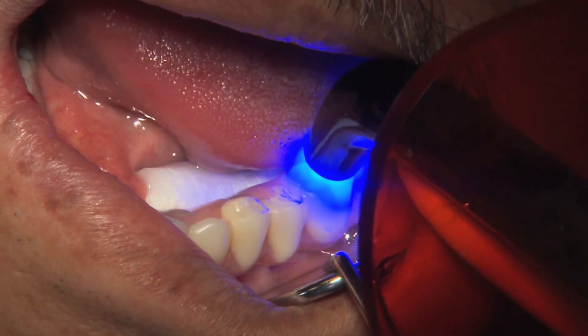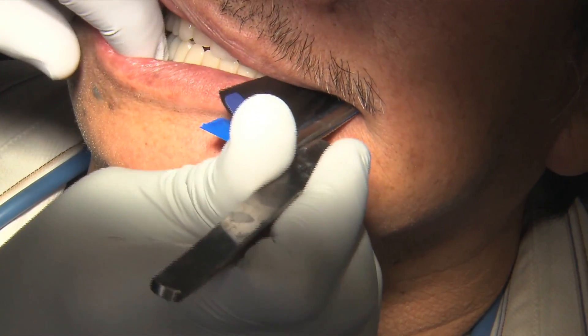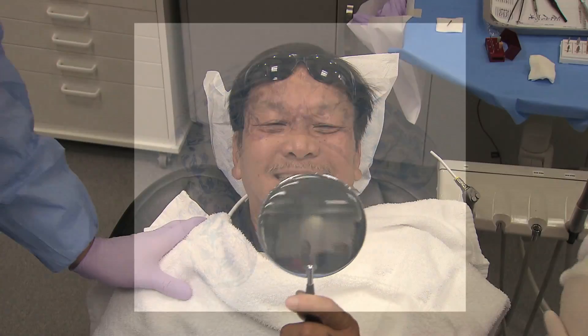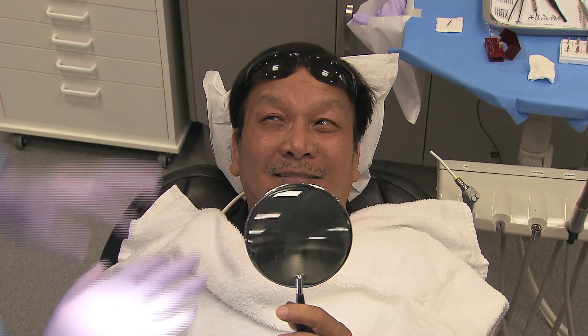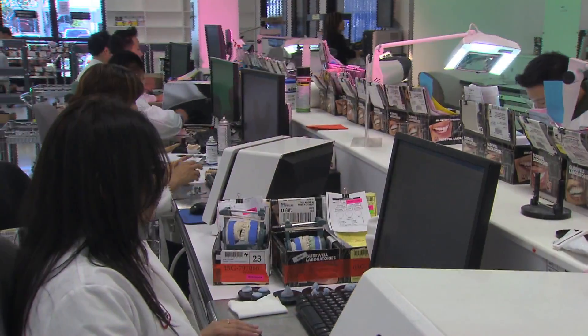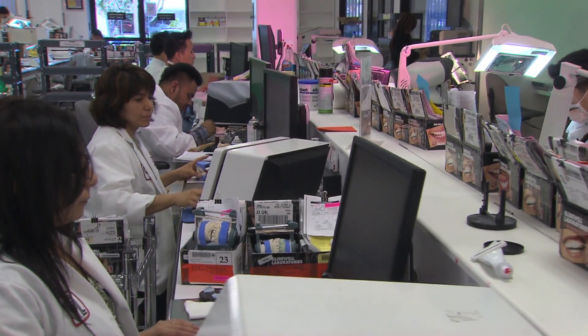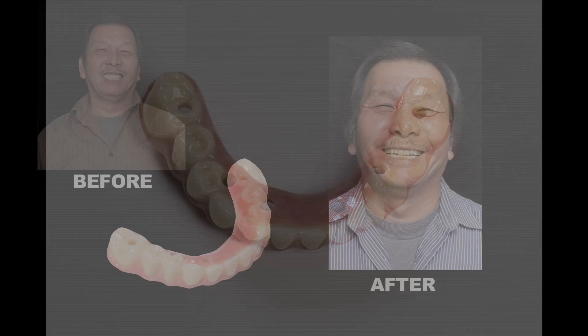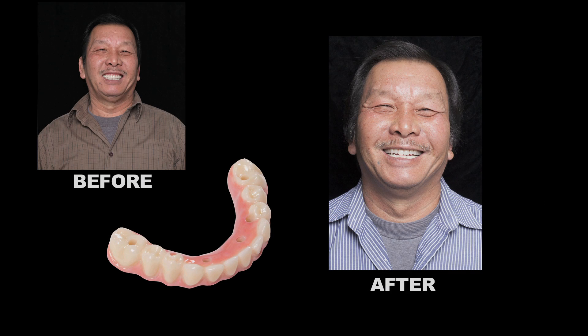After the doctor receives the prosthesis and delivers the final restoration, the lab fabricates an occlusal splint. The bite splint offers added protection to the appliance itself and relieves undue stress on the temporomandibular joint. With the production of the Bruxer Solid Zirconia Full-Arch Implant Prosthesis, the lab has played a leading role in the application of digital technology to restorative dentistry and the concomitant role of implants. Ultimately, it is the patient who benefits from the precision of the design and fabrication process by receiving a durable, well-fitting, and aesthetic restoration.